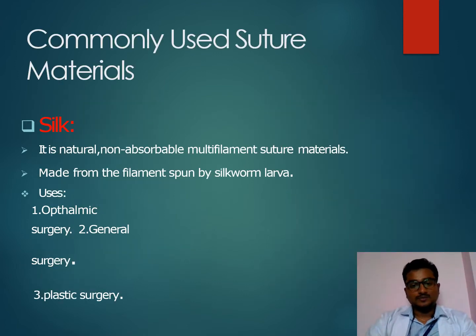Silk is a non-absorbable multifilament suture material made from a filament spun from a silkworm larva. Uses: ophthalmic surgery, general surgery, and plastic surgery.